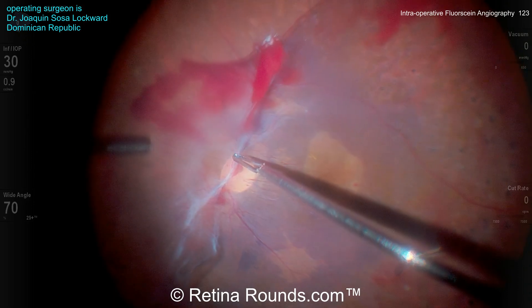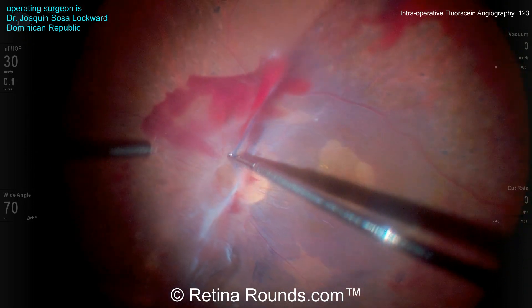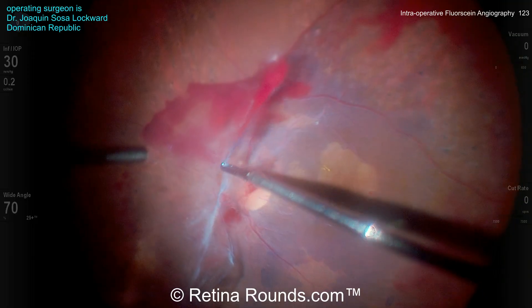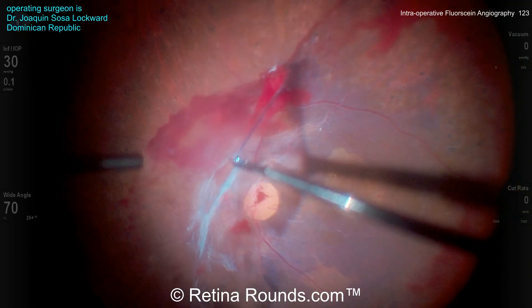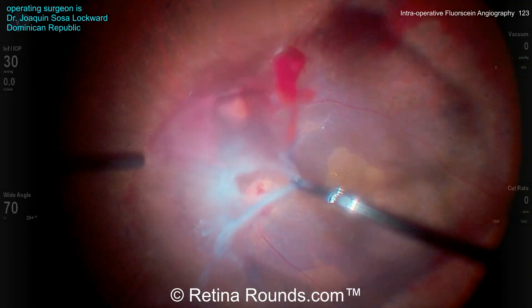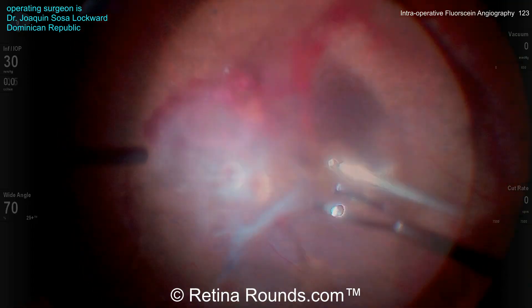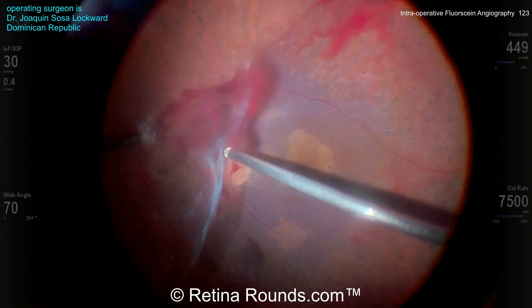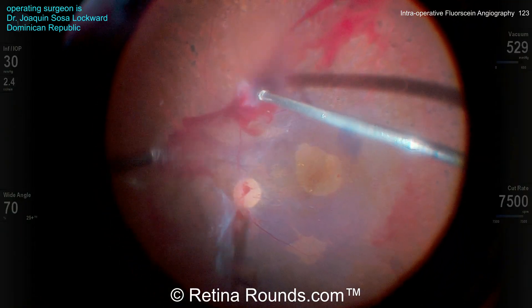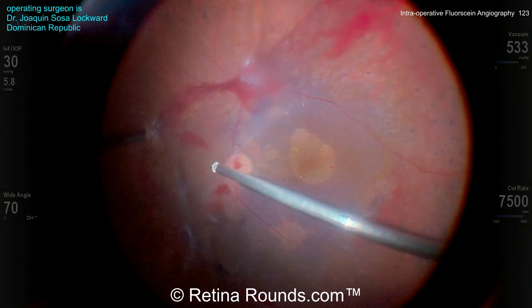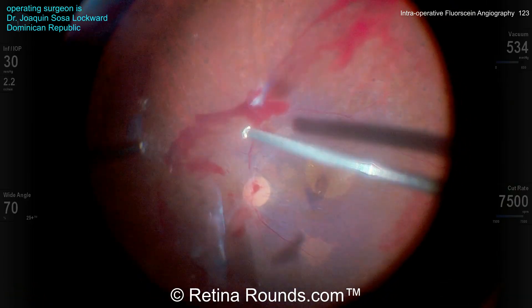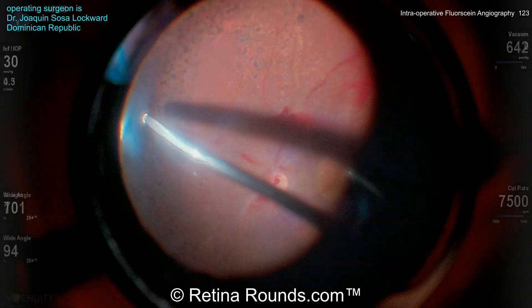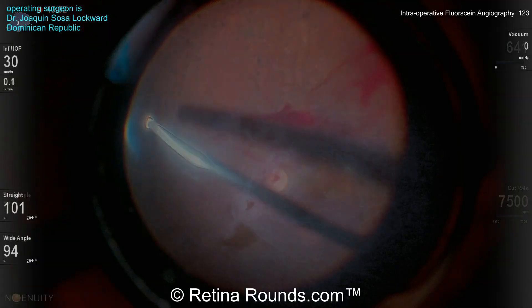Once that's done, he's going to divert his attention towards the fibrovascular membrane around the optic nerve. You can see here that there is some hyloid that's still attached to the retinal surface nasally. He's going to elevate that up with the forceps and then use the cutter to clean all of that posterior cortical vitreous off of the retinal surface. Some peripheral shaving is performed as well.